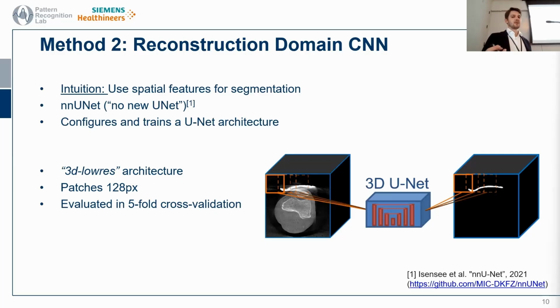However, what we're doing now is not projection domain segmentation, but 3D segmentation based on projections. So using the method as it is implemented now or thought of as of now, it wouldn't be possible because we're only able to reconstruct metal that's within the volume that we also reconstruct within the method, right? So if the metal is outside of the volume, we wouldn't catch it. Okay, thank you.